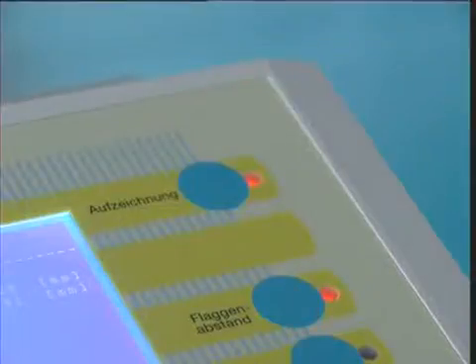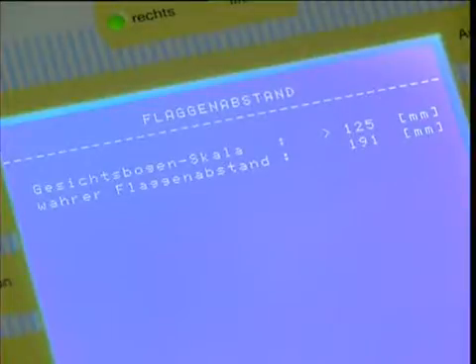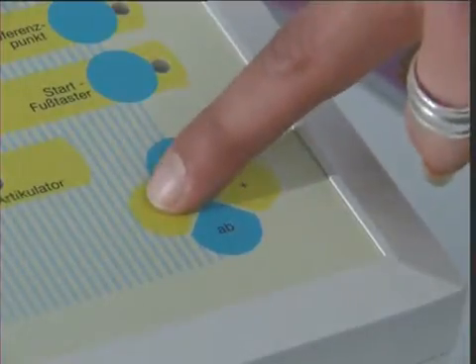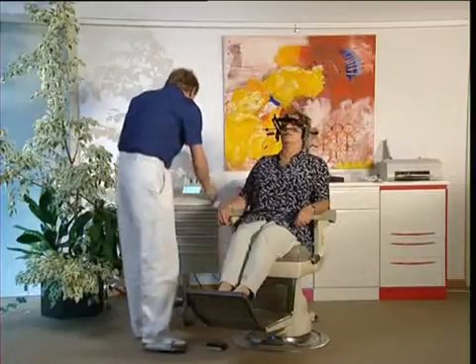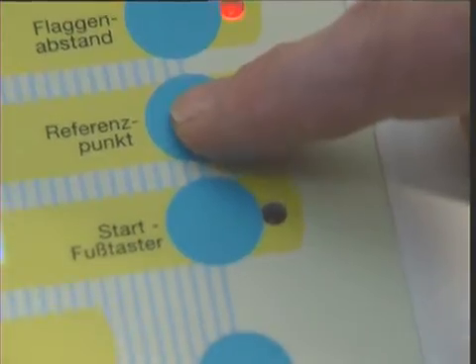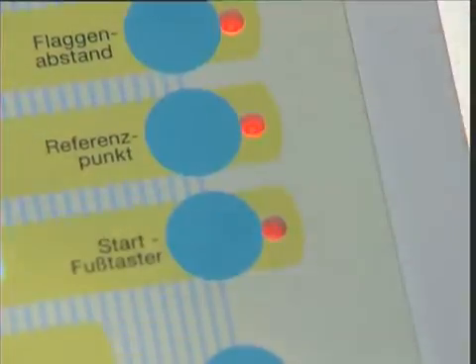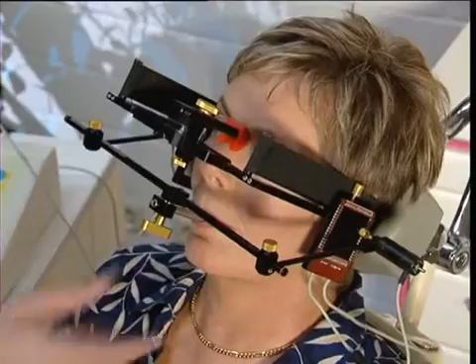The trace and tracing sheet distance LEDs flash. The distance between the tracing sheets can be read off the front scale on the face bow. This value is then entered with the plus/minus keys. Pressing the reference point key confirms the distance between the tracing sheets. The reference point and foot switch diodes flash. Completed procedures, in this case the tracing sheet distance, illuminate continually, and running stages flash.